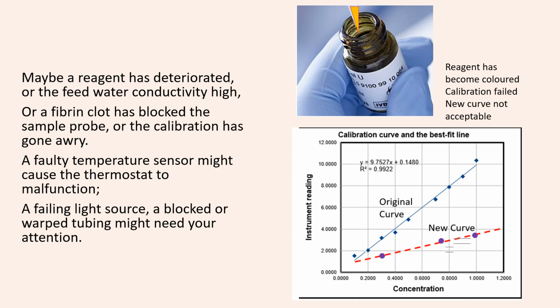Maybe a reagent has deteriorated, or the feed water conductivity high, or a fibrin clot has blocked the sample probe, or the calibration has gone awry. A faulty temperature sensor might cause the thermostat to malfunction. A failing light source, a blocked or warped tubing might need your attention.